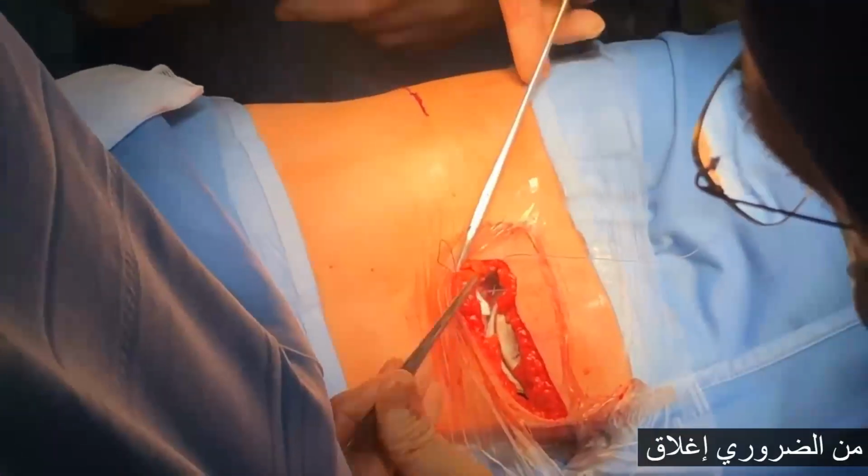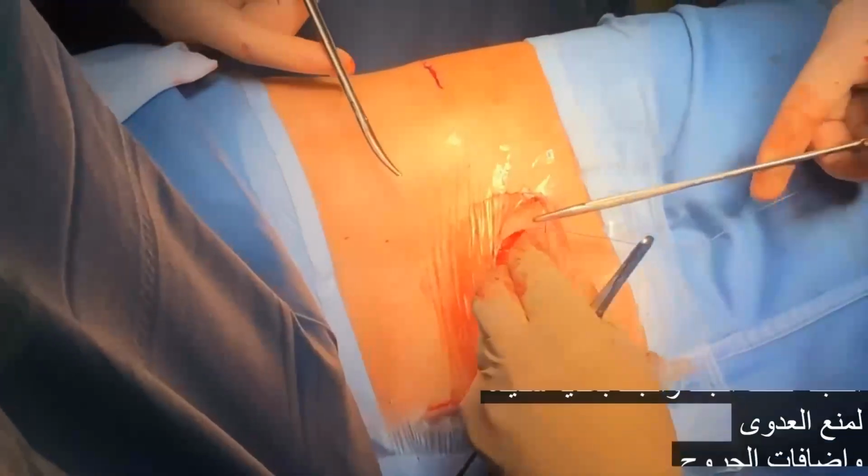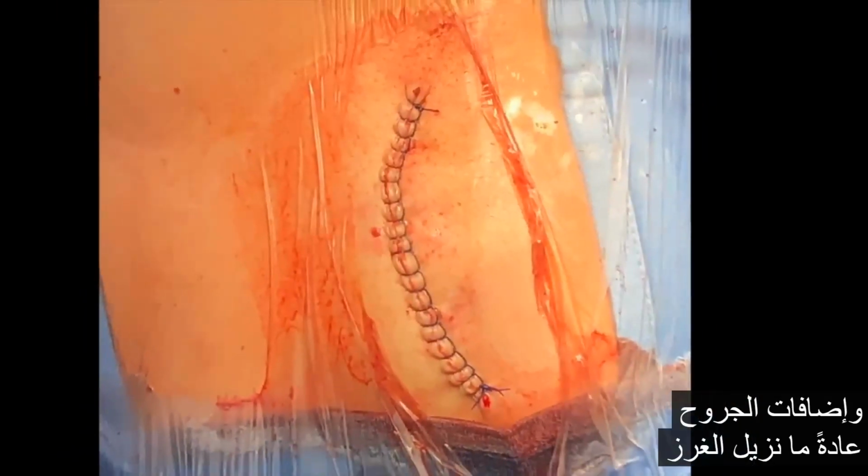It's essential to close very carefully the subcutaneous and cutaneous layer in order to prevent infections and adhesions of the wounds. Usually, we remove stitches 2 weeks after surgery.